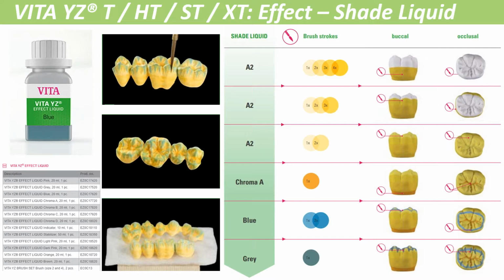And these are all internal stains that, when we talk about light transmission and color, the more color we can get coming from the inside, the more natural it's going to look. Again, the problem we have with zirconia is that it is very dense, very dead, and so it's really difficult to get a lot of light transmission in there.